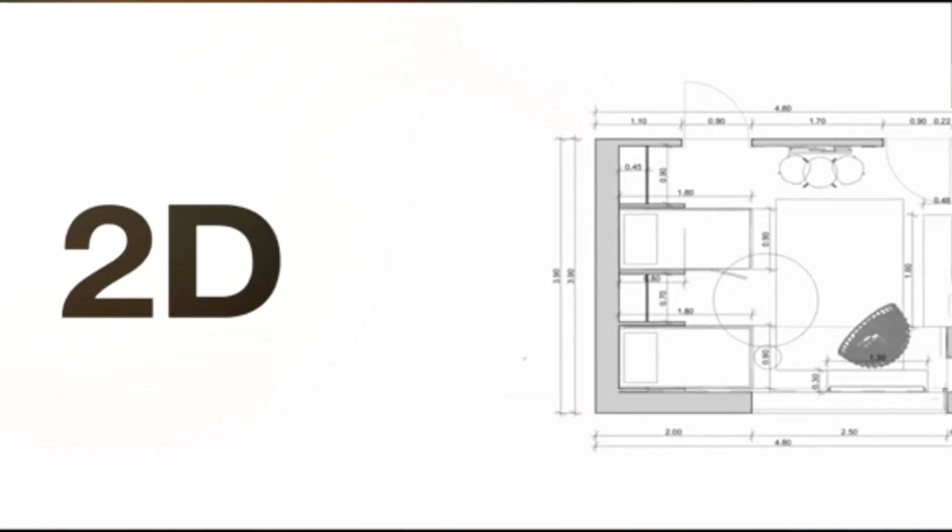So the second you have the data, in architecture, you always start with a 2D plan. Now, why is that? Because these people are the best in 3D. However, they always start in 2D. And they have all the softwares. I mean, everything we have as advanced software in dentistry is somehow imported and inspired by either architecture or engineering. But the process, it doesn't matter if it's on a software or on a piece of paper, always starts 2D. Because to put it simple, it's systematic thinking.